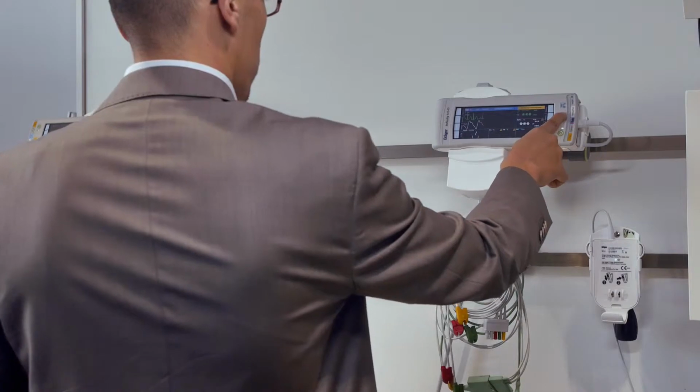When the patient becomes more critical, then we need to have more advanced measurements, such as invasive blood pressure. And the invasive blood pressure gives us information on whether the patient is hypotensive, so a low blood pressure, or hypertensive, a higher blood pressure.